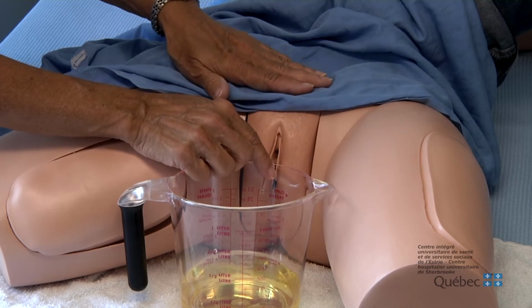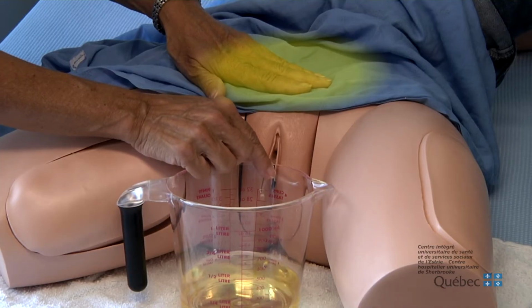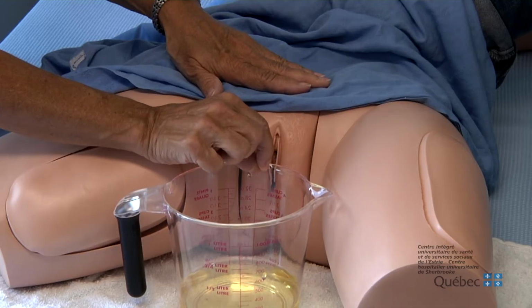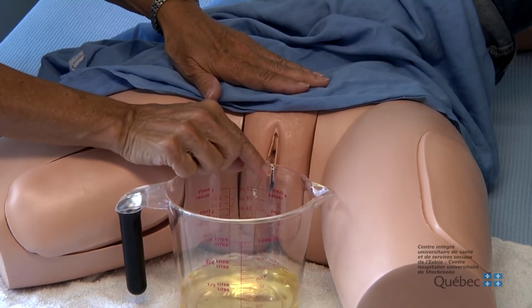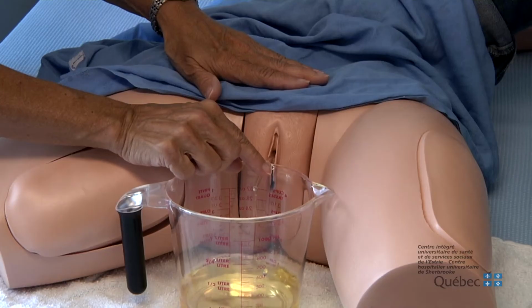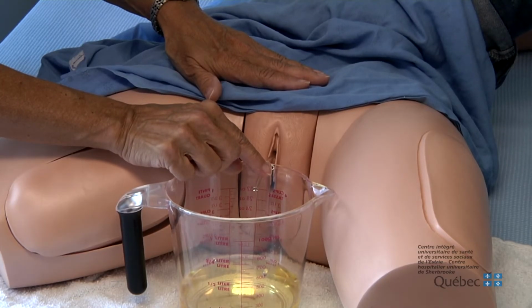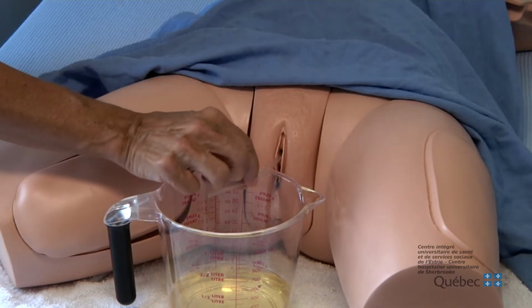When urine stops flowing, apply slight pressure to your abdomen over your bladder to make sure that it is empty. If no more urine flows, slowly remove the catheter. If urine begins to flow again, stop removing the catheter and wait until urine has stopped flowing. Then, continue gently removing the catheter.